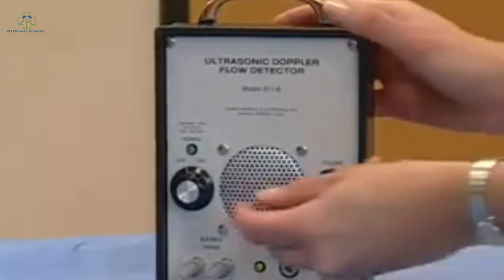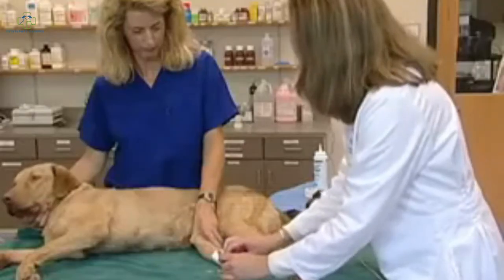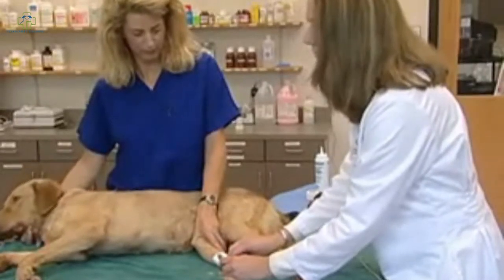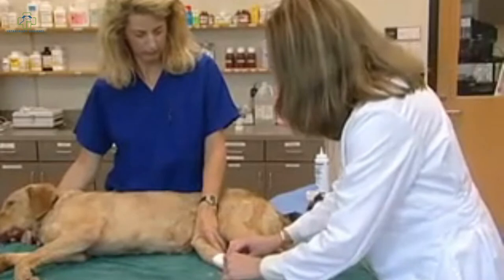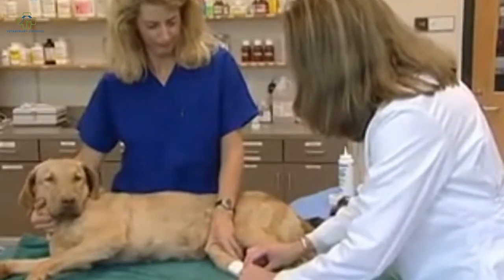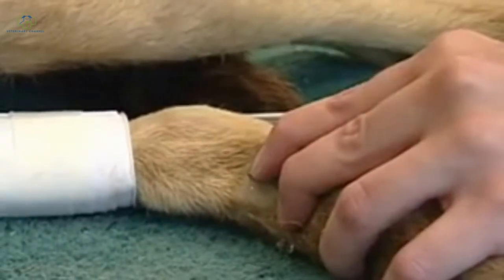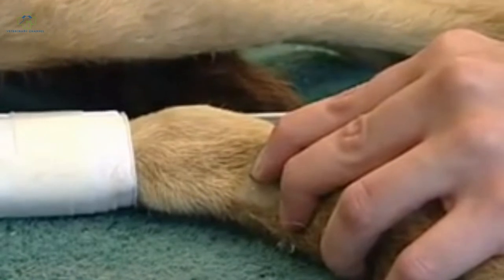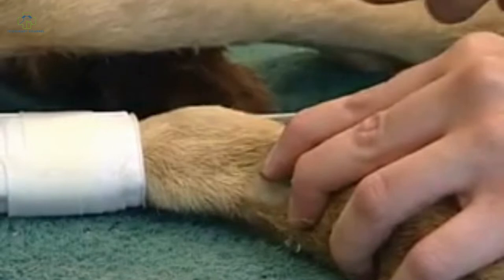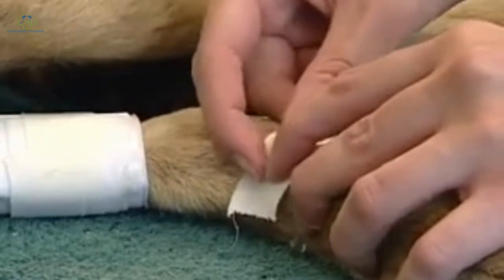I'm going to turn the machine on so we can hear the artery pulsating. Sometimes the noise can be distracting to some animals, and you can use headphones to try and minimize the distraction. I'm now going to move the probe until I can locate the artery. Once we've obtained a good pulse and can hear the pulsation of the artery very well, you can go ahead and tape the probe in place so as to maintain the position.